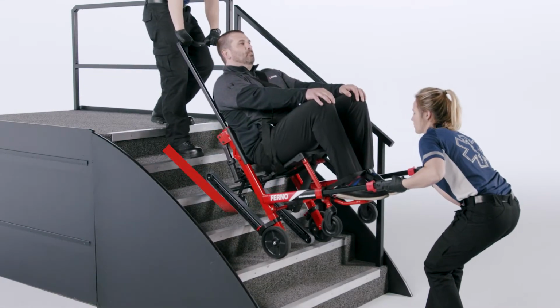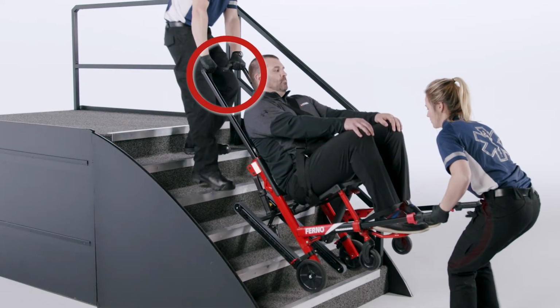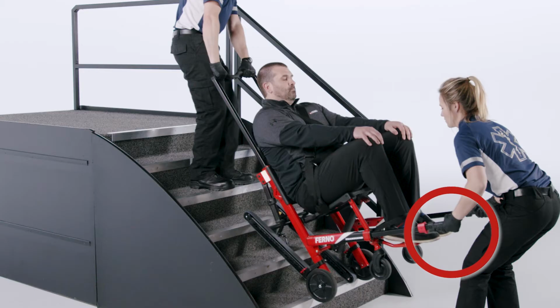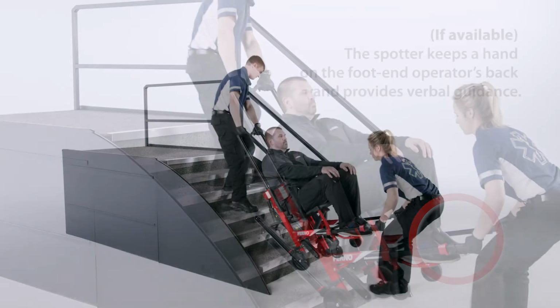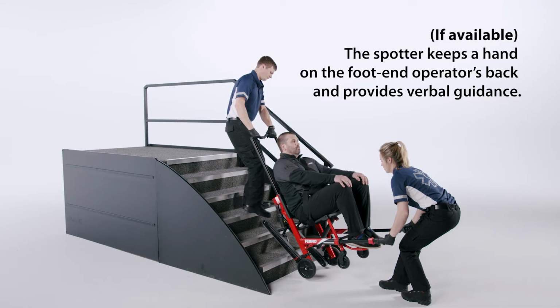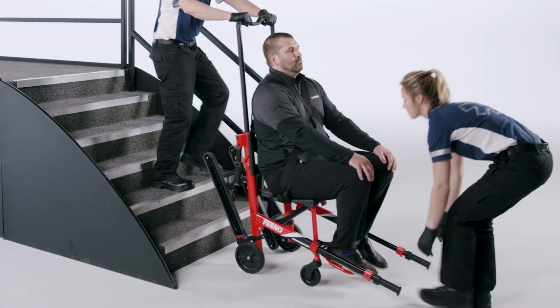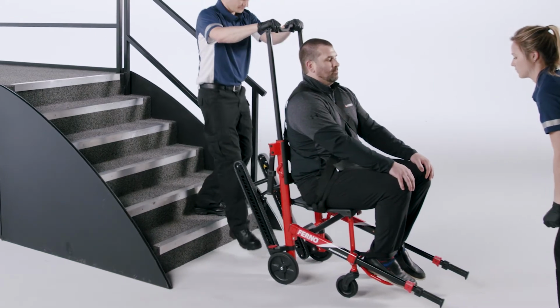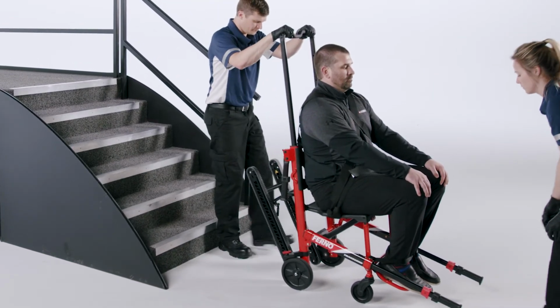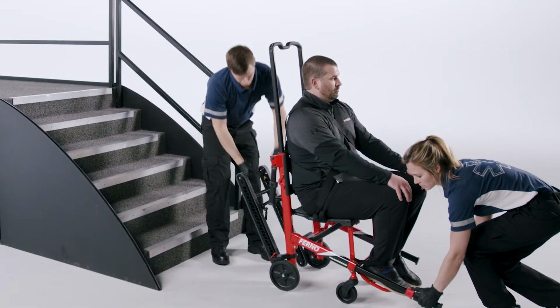To maintain the glide angle, apply slight downward pressure on the lift bar and slight upward pressure on the foot end lift handles. The spotter, if available, keeps a hand on the foot end operator's back and provides verbal guidance. At the bottom of the stairs, tilt the chair onto all 4 wheels. Retract the lift handles, adjust the lift bar, and close the track system.